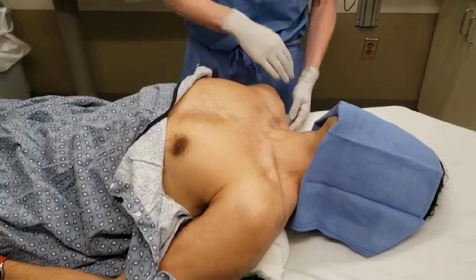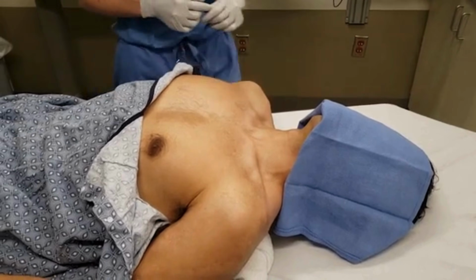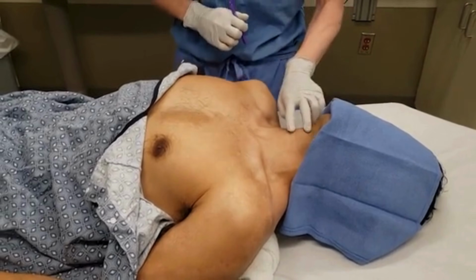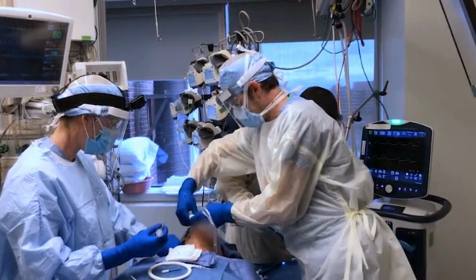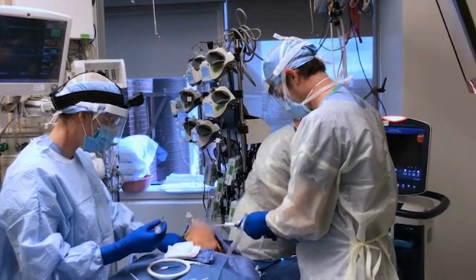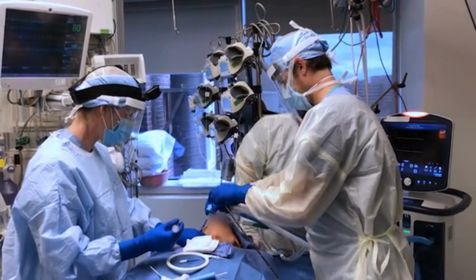Position the patient supine. A shoulder roll under the scapula can extend the neck and improve anterior neck exposure. Support the head with a towel or small pillow if needed. Adjust the bed height for surgeon comfort. Ensure each team member is positioned for safe, effective, and efficient procedures.